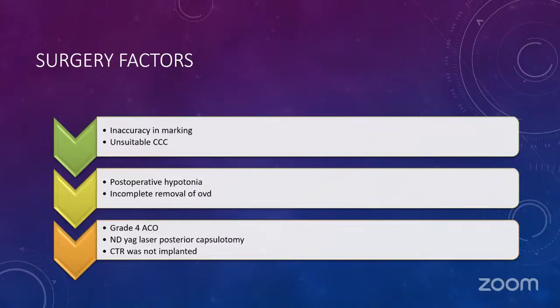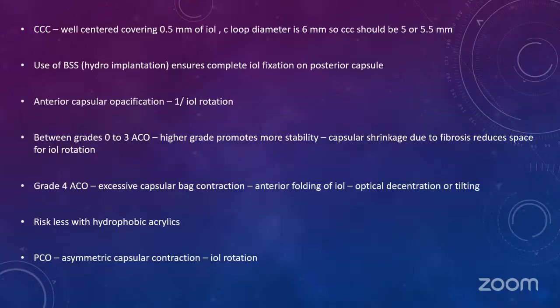Post-operative hypotonia, incomplete removal of OVD, grade 4 ACO, Nd:YAG laser posterior capsulotomy, and if the CTR was not implanted. So we'll see them one by one. CCC, like I said, should be well centered, covering 0.5 mm of the IOL.